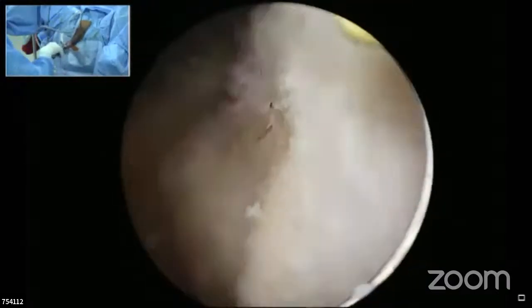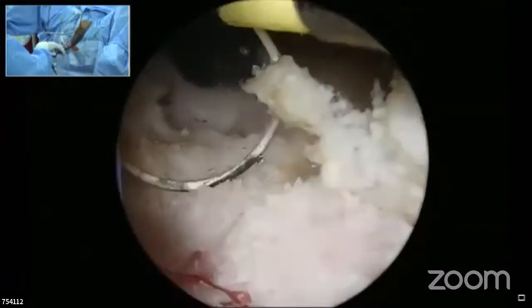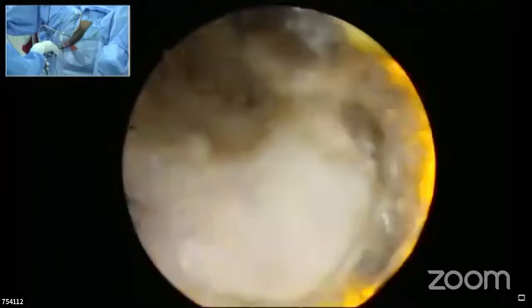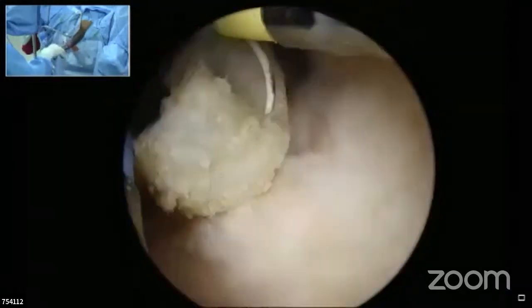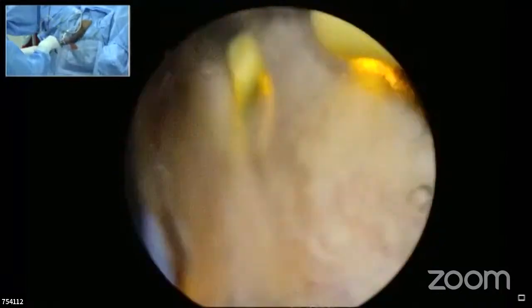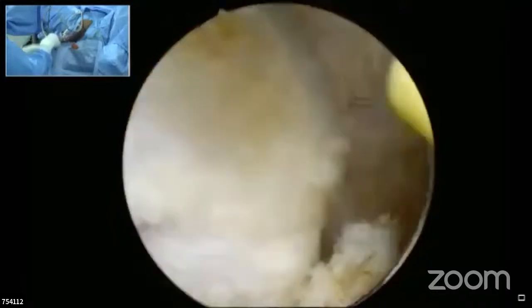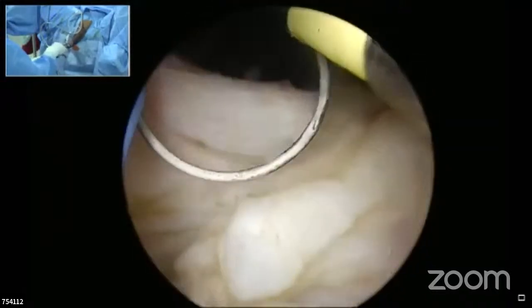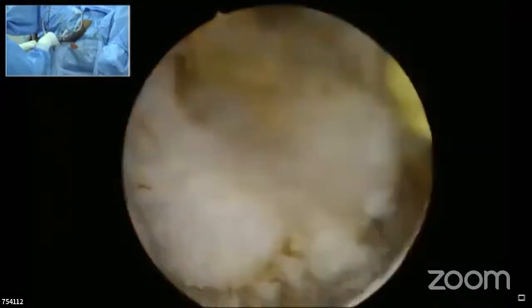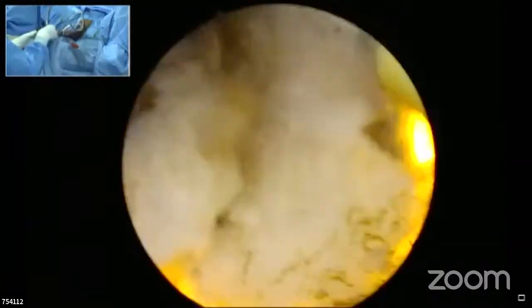Only they want to know the cost of the bipolar loop and how many cases it lasts. I think it is cost effective. I think it's costlier than the monopolar, but once you get used to it, the life of the loop is good. The only disadvantage, as I said before, is that when you shift from monopolar to bipolar, you continue to resect in the same fashion as you did in monopolar, which will end up in losing the loops.